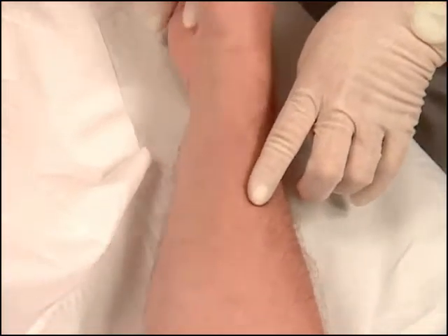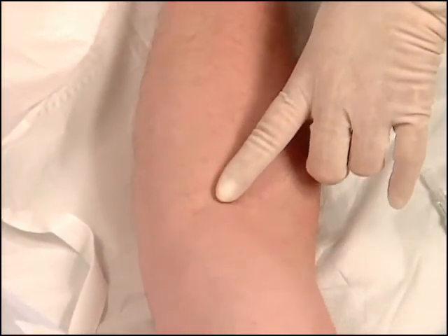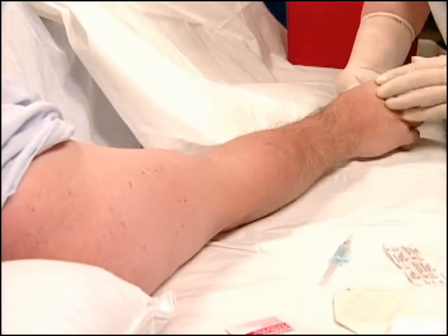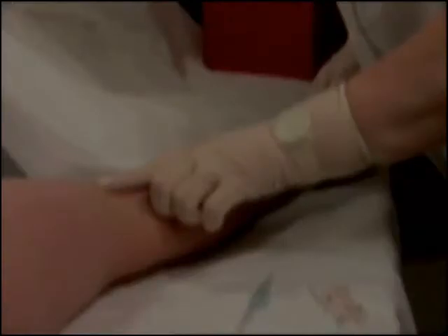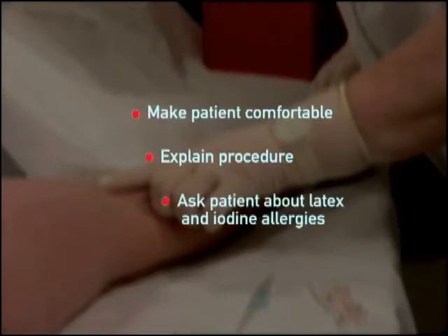Gently turn the arm, view all potential insertion sites, and select the most appropriate one based on the patient's condition and reason for insertion. Ask the patient if he or she has any known allergies. Check specifically for latex and iodine allergies. If a latex allergy is noted, use all non-latex products. If an iodine or seafood allergy is noted, cleanse only with alcohol.